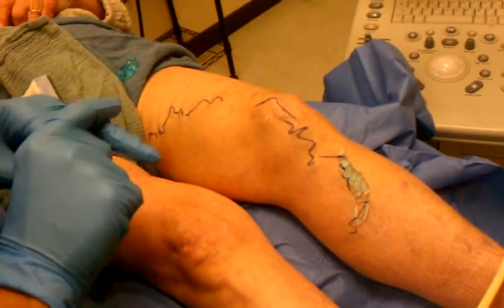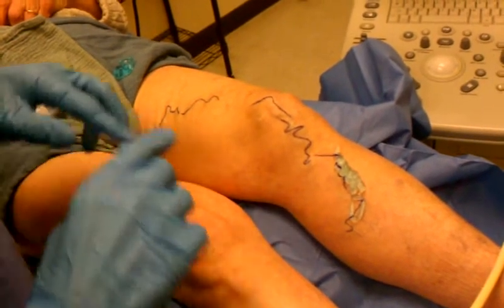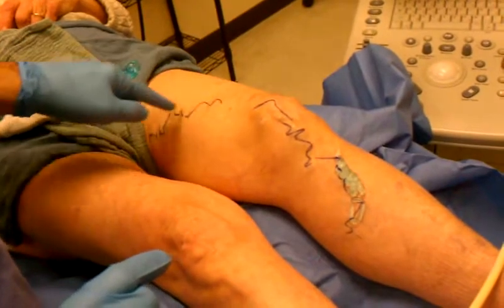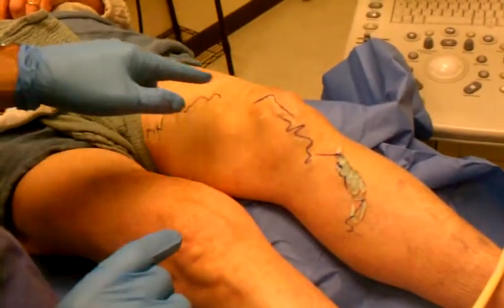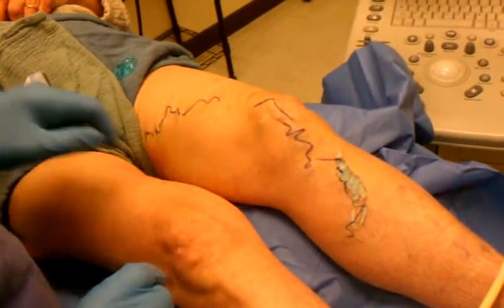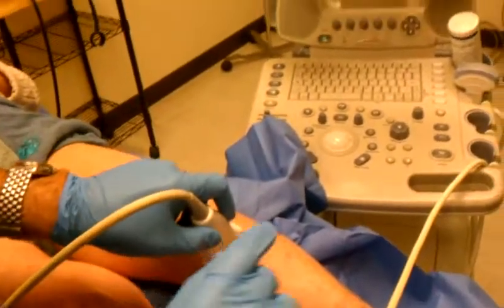We're doing foam sclerotherapy under ultrasound guidance today. This is an anterolateral branch of the great saphenous vein. I marked it, but we're going to use ultrasound. The marking is just for visualization on video, and we're also going to show you on the monitor what these veins look like, so you get an idea.